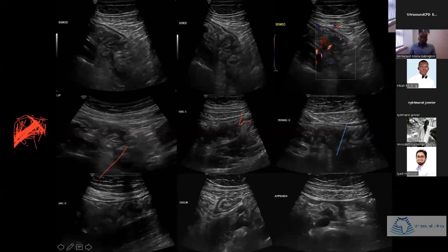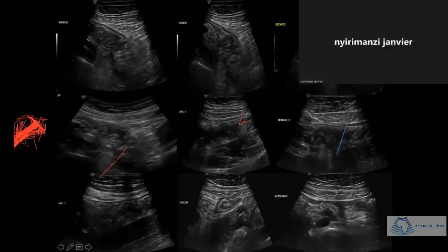And the cecum is the normal, fine normal sequence. And you can just make out the appendix here. So that's the appendix there. You can see the iliac vessels there. The appendix and cecum were normal, while the ascending, transverse, descending, and sigmoid colon were all thickened.